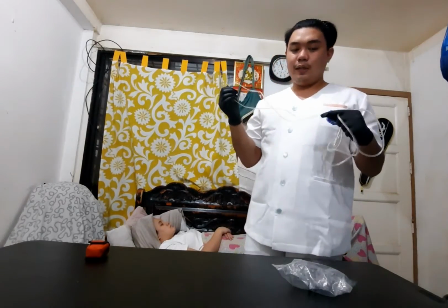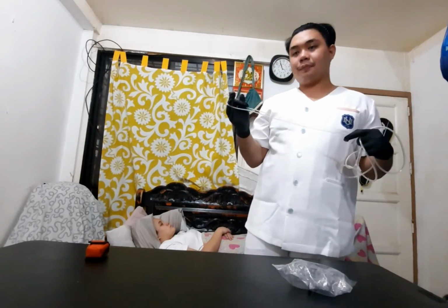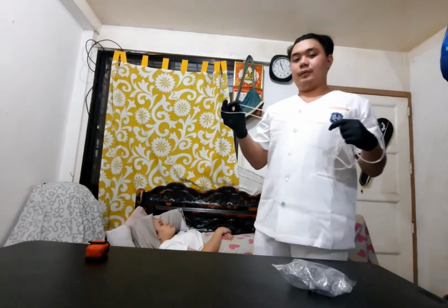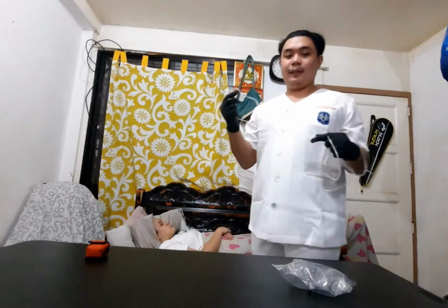If the cannula will not stay in place, tape the side of the face using Eucoplast or any tape that can hold the tubing on the patient's face.